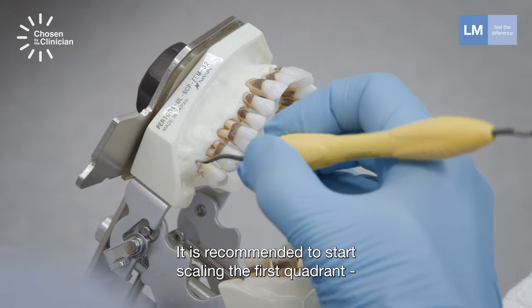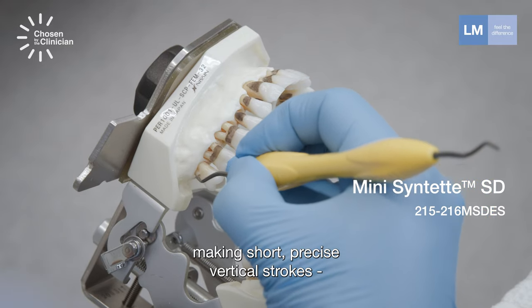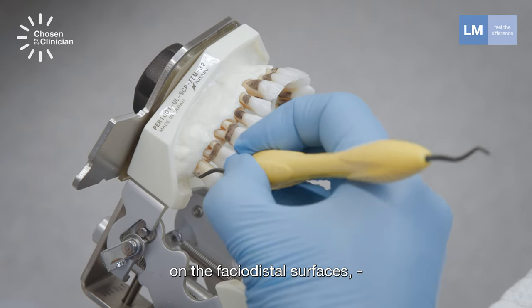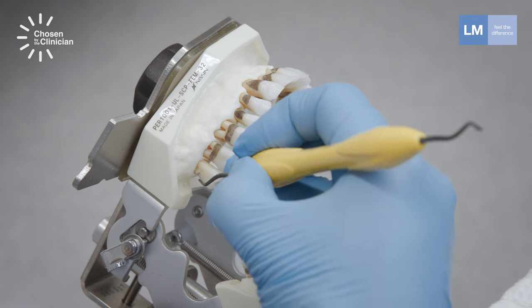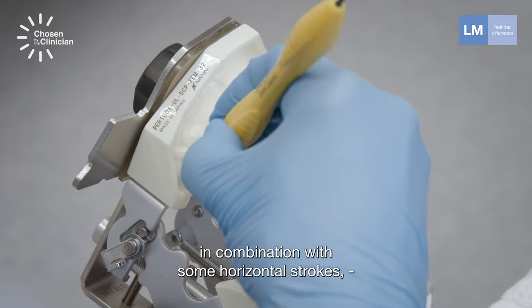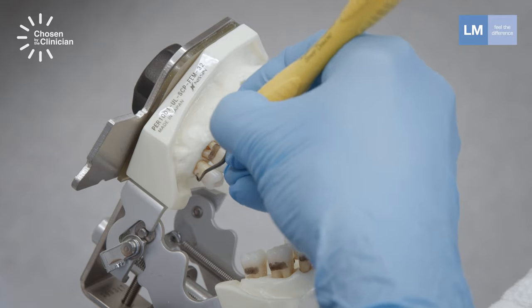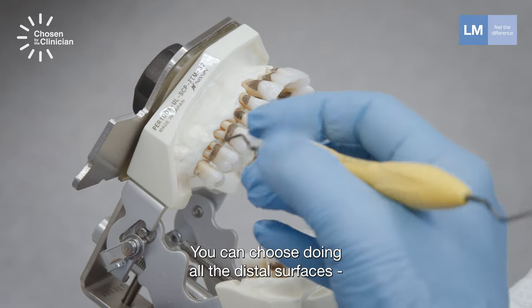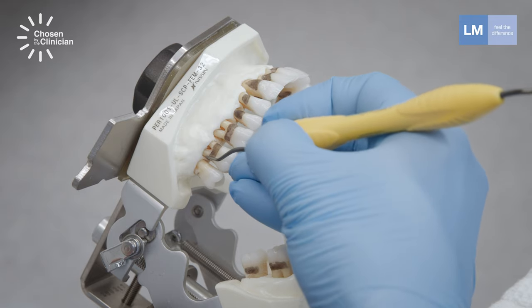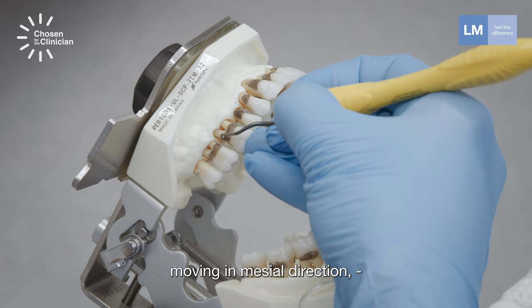It is recommended to start scaling the first quadrant, making short, precise vertical strokes on the facial and distal surfaces, in combination with some horizontal strokes if it is necessary. You can choose to do all the distal surfaces with vertical strokes to start with, moving in mesial direction.